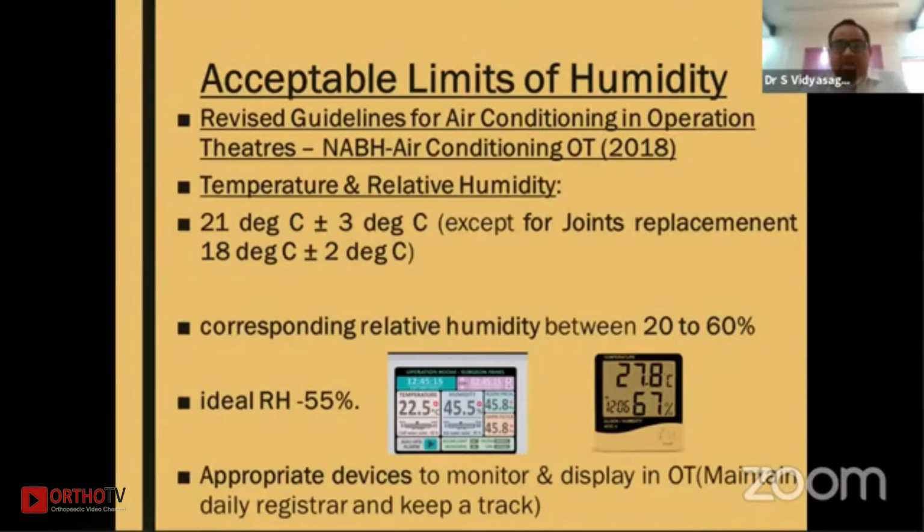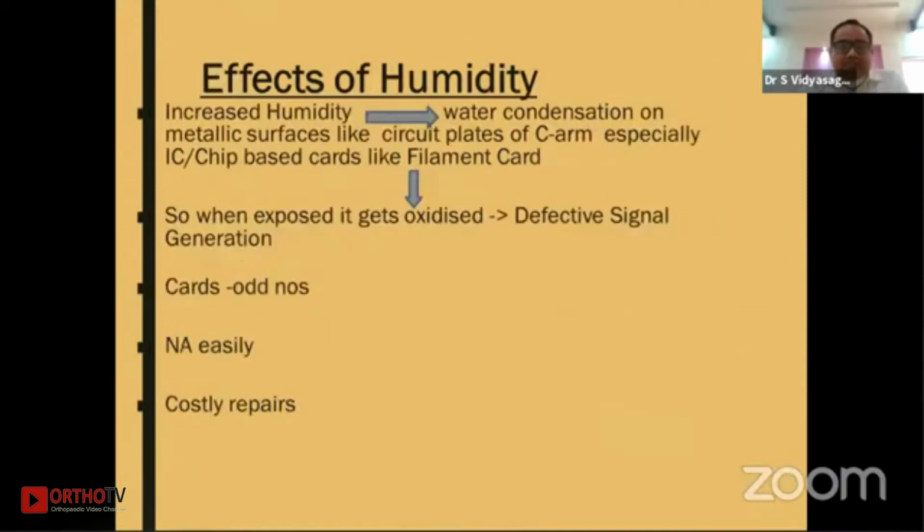These are some of the devices. One is a higher end device, a surgeon-operated surgeon panel. These are some of the cheaper devices which we have to monitor and display in the OT. You have to keep a check of this. You have to ideally keep a register checking the humidity at least thrice in a day: early morning, mid afternoon, and the late night.